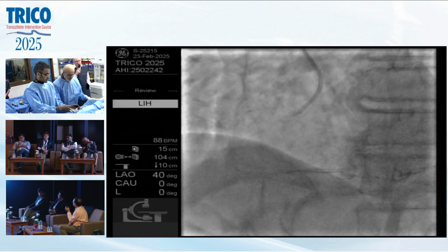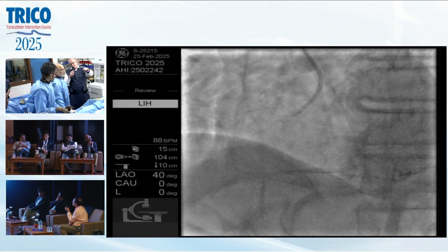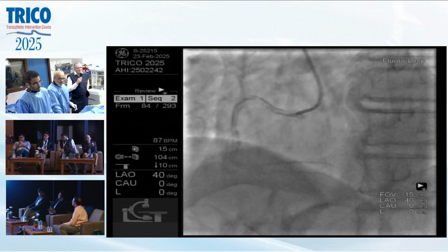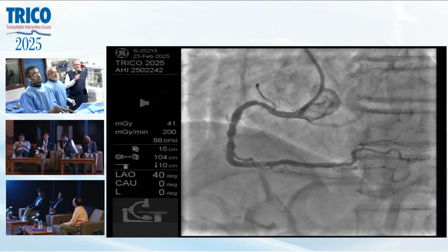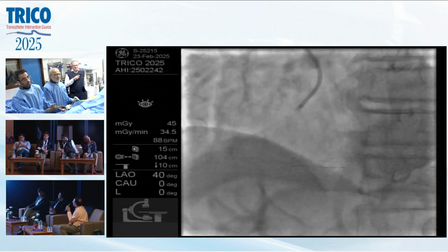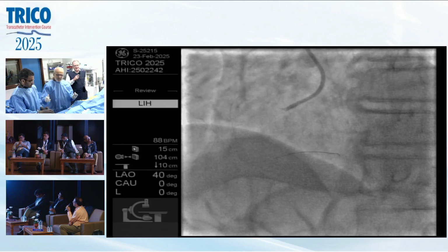For the learners in the audience, do you want to just remind them which way you were turning that catheter? Clockwise. Okay. Inject. I do see it there. I will still try to maneuver the catheter a little more. If it doesn't, no worries. Keep it like this. Get me the wire now. And again, I will heavily depend on the shape of the wire.